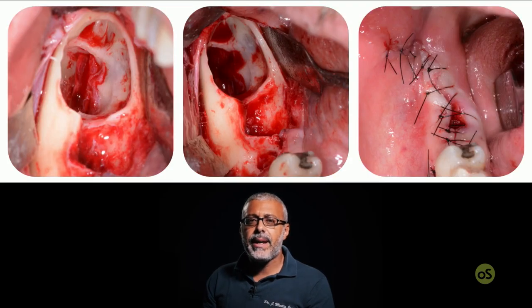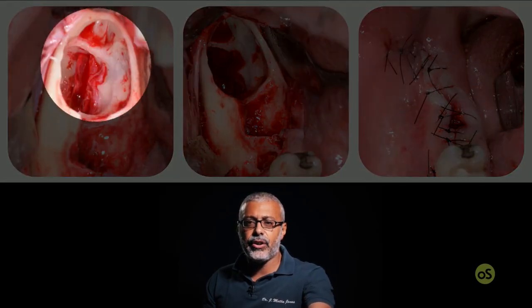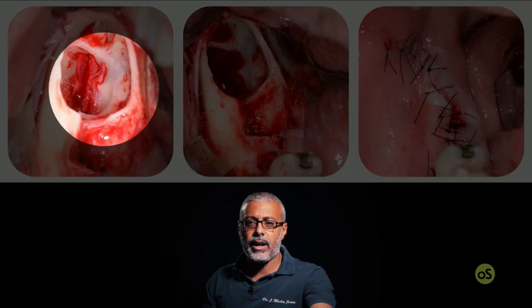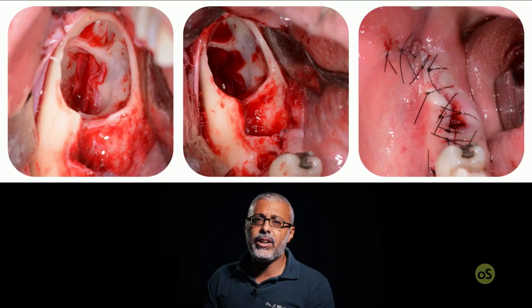And this makes us also see that in this particular case we had the inferior alveolar nerve outcoming in the underlying area of the tooth that we had extracted, and then after a clear and complete cleaning of the two sockets, we can perform a primary closure of our wound.